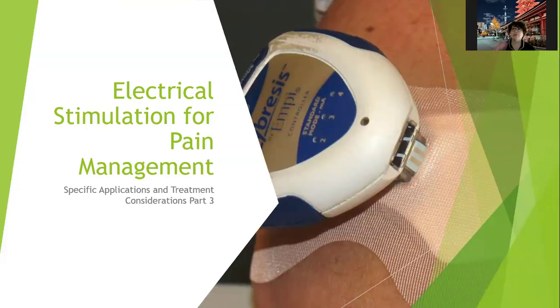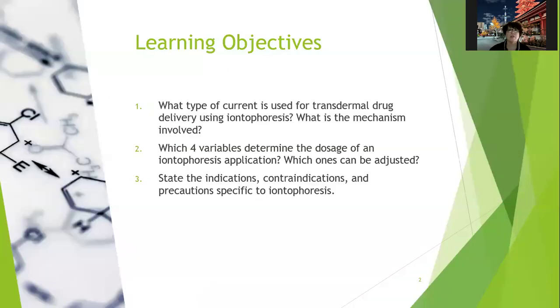So the last application we're going to talk about for electrical stim for pain management is iontophoresis, which uses direct current, of course. And then we're going to talk about some treatment considerations just overall for e-stim and some outcome measures that we might want to use for e-stim.